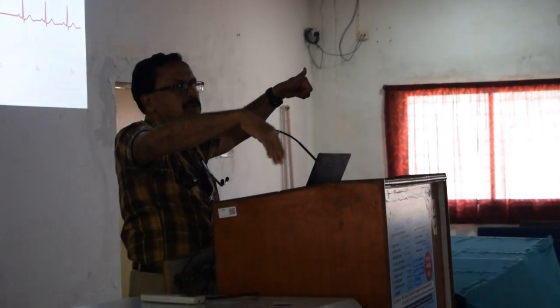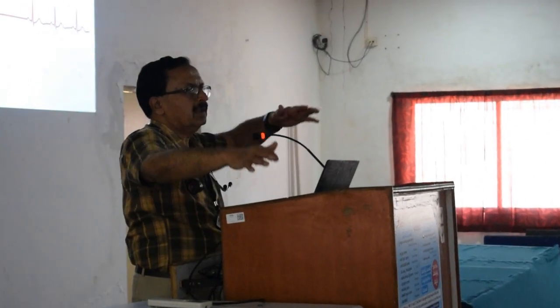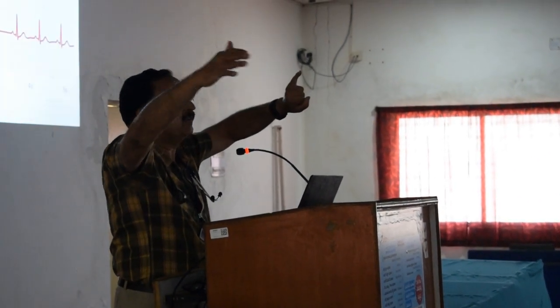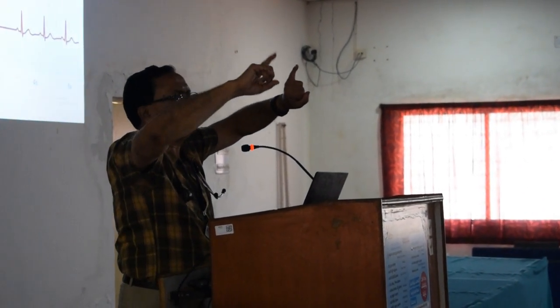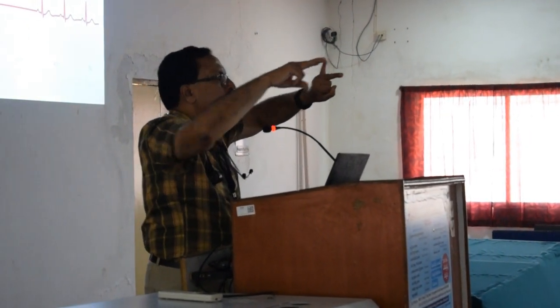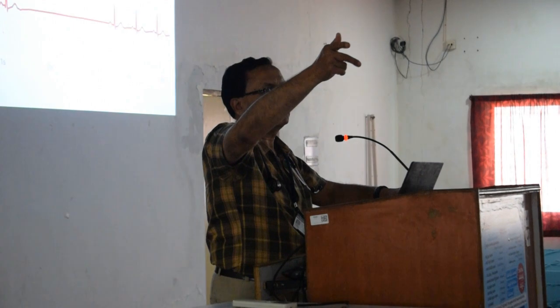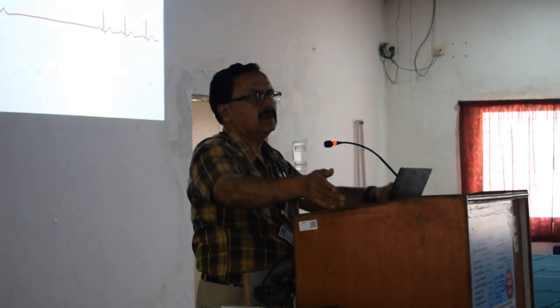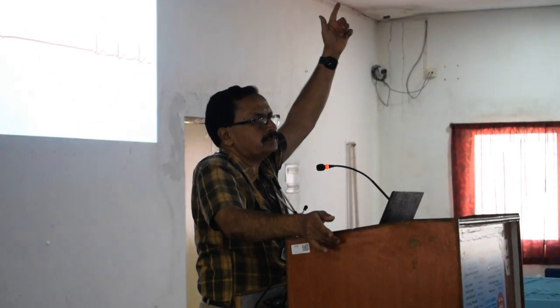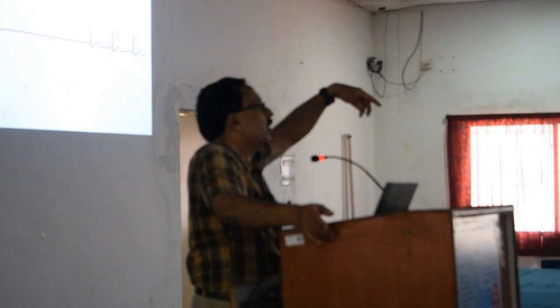Again, I am sure we will show you in the ECGs that there is grading of ectopy. These ectopics can be occasional, meaning in one 25 millimeter frame, 5 or 6 seconds, we are getting only one ectopic beat. Or it is possible that I can get two ectopic beats together, which will be called ectopic couplets. But the clinical importance is that when there is ectopy, the blood is not going to reach the brain. And therefore, we have the next question, what is Stokes-Adams syndrome?